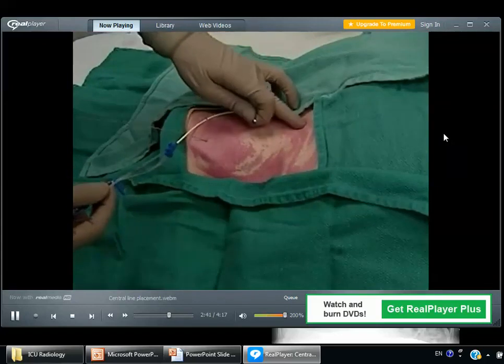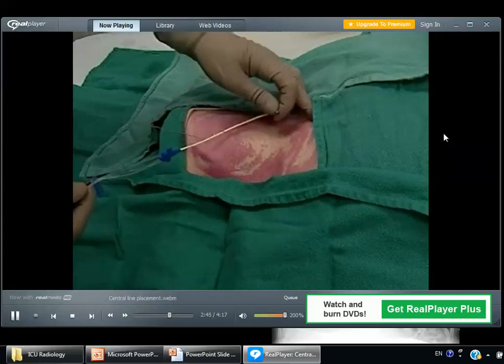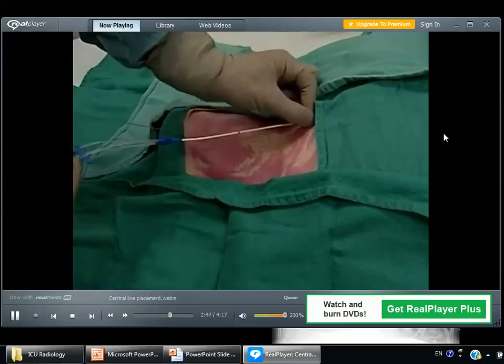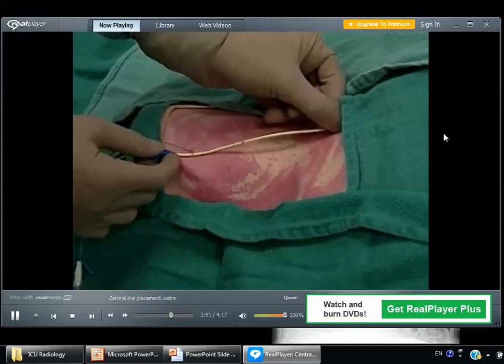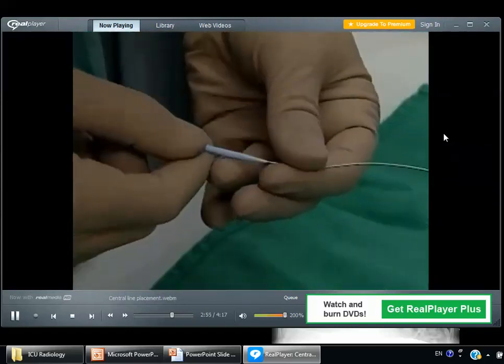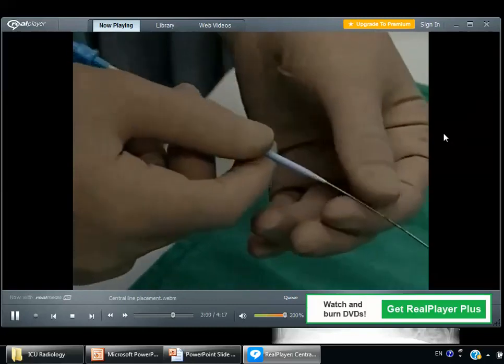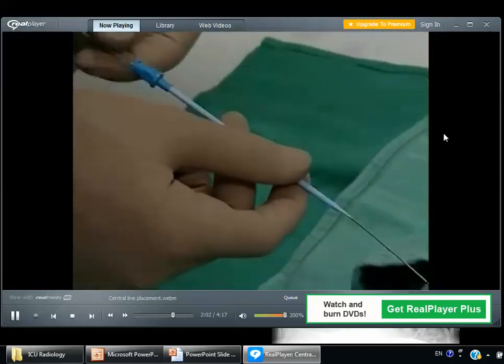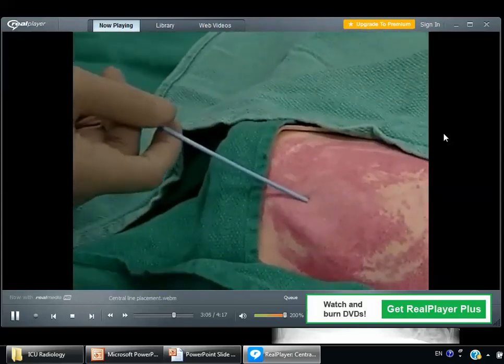Before we begin, we palpate that sternal notch. Lay the catheter tip at the sternal angle with the other end to the needle entry point, and we can see the catheter is the right fit for this patient. We advance the dilator over the wire, advancing carefully to dilate the soft tissue, still holding the end of that wire with one hand.